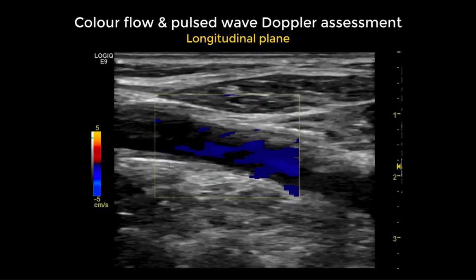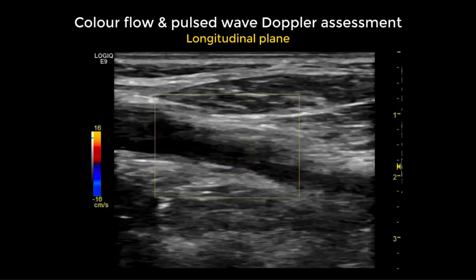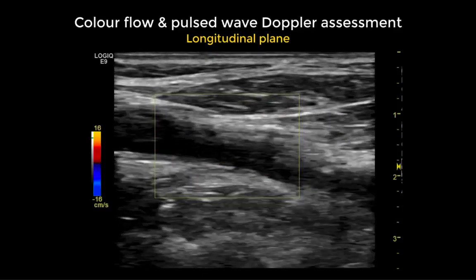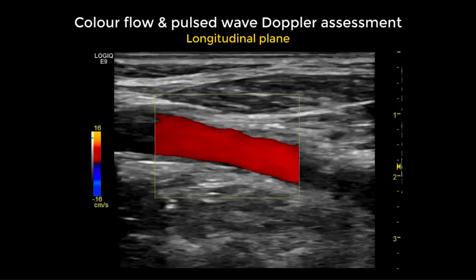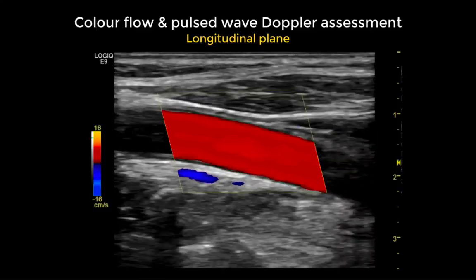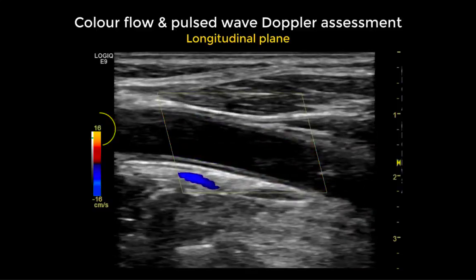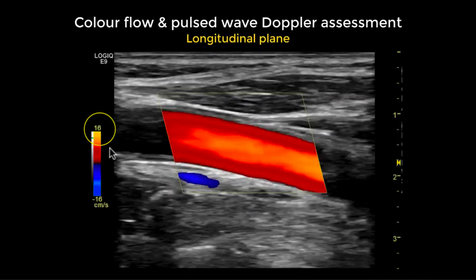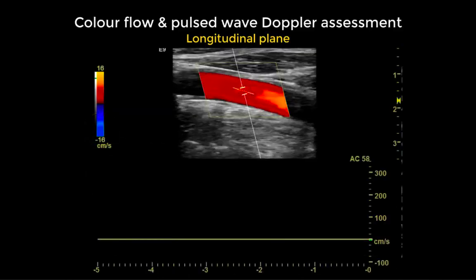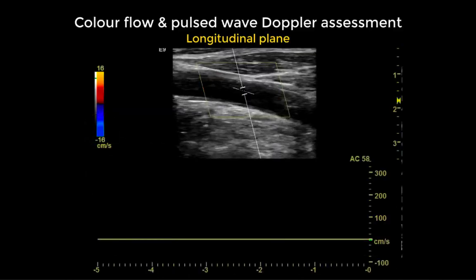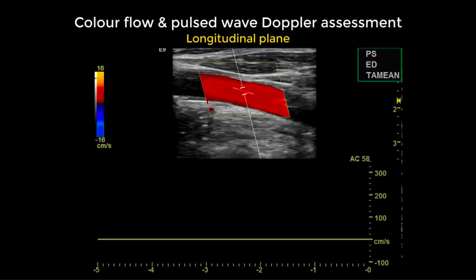We continue the assessment using the longitudinal mode, turning the transducer, optimizing our colour box, steering it parallel to the flow direction. We maintain a very low scale and then apply the pulse wave Doppler.